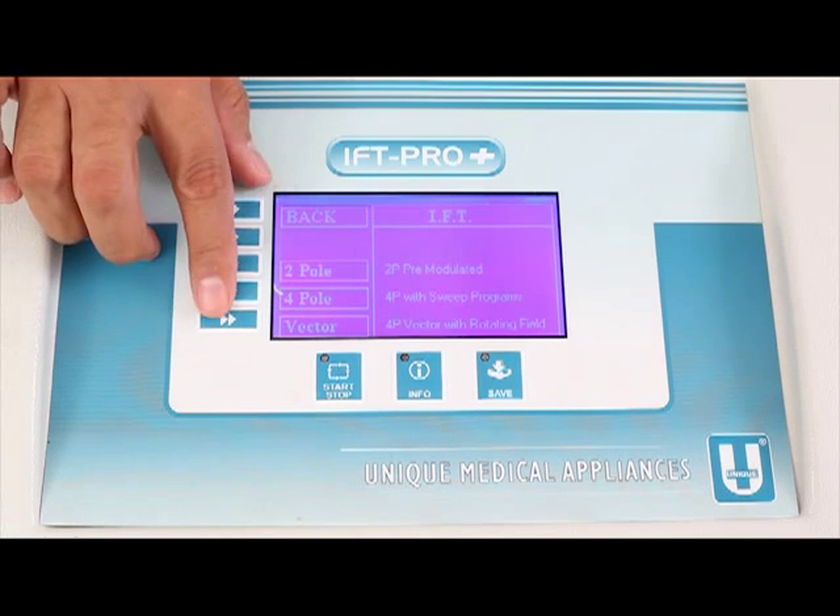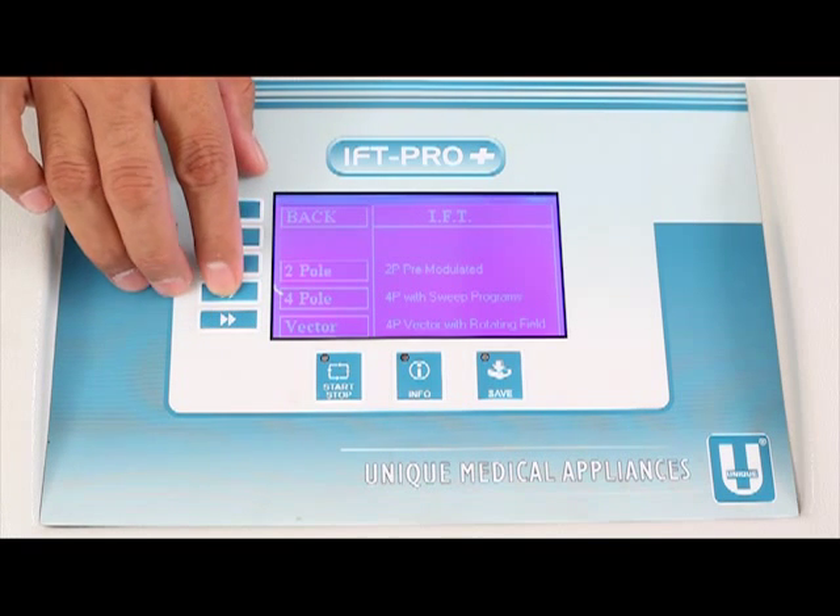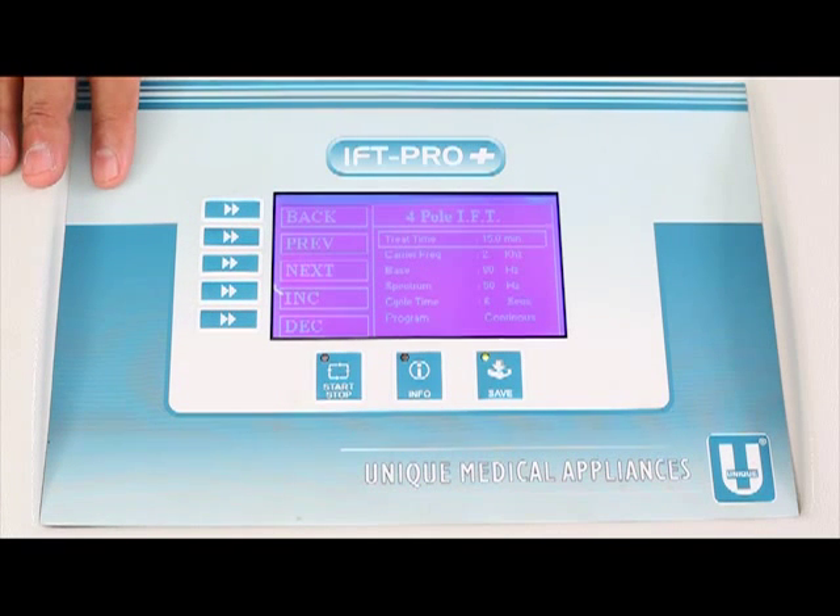Pressing F4 enters the Four Pole submenu: F1 Back, F2 Previous, F3 Next, F4 Increase, F5 Decrease. The parameters menu then announces all pre-selected values: Treatment time 15 minutes, Carrier frequency 2 kHz, Base 80 Hz, Spectrum 50 Hz, Cycle time 6 seconds, and Program.